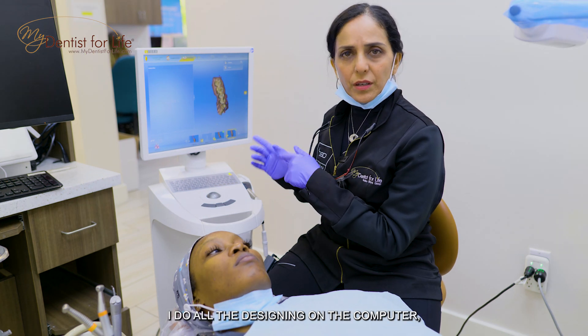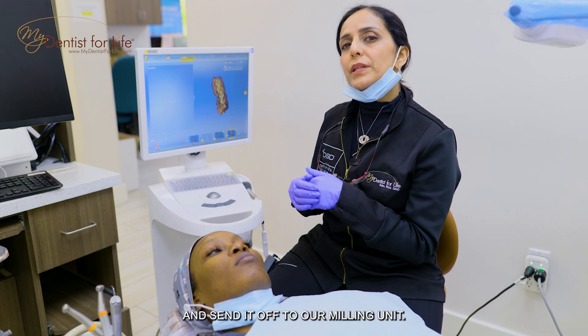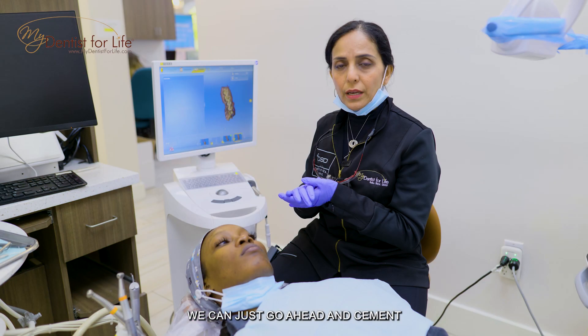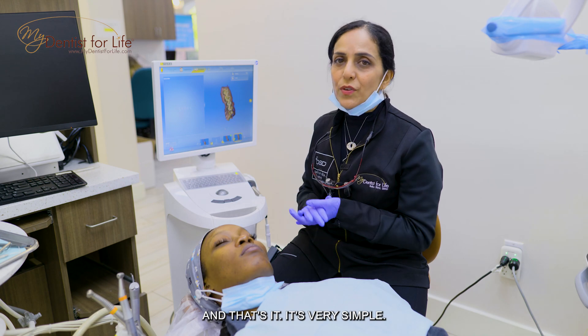I do all the designing on the computer, design the ideal crown, and send it off to our milling unit. Each crown gets milled and it takes about 10 to 15 minutes. Once it comes out, we go ahead and cement these crowns in — and that's it. It's very simple.